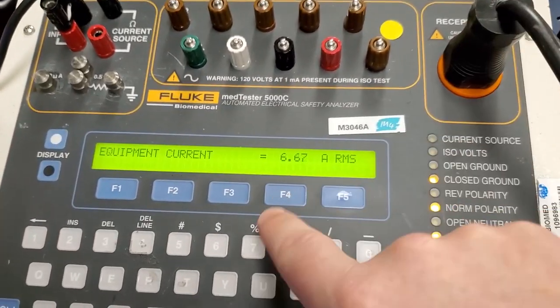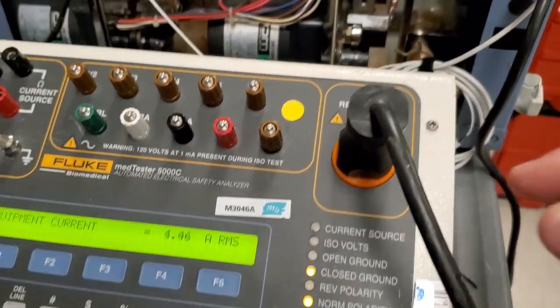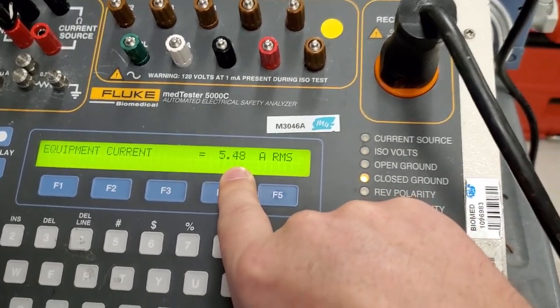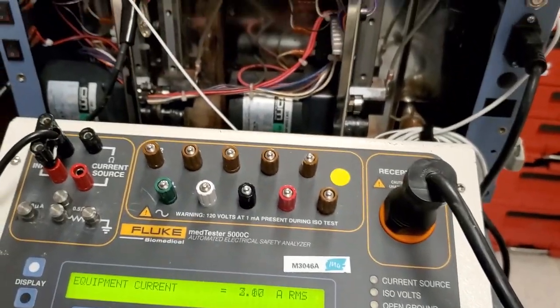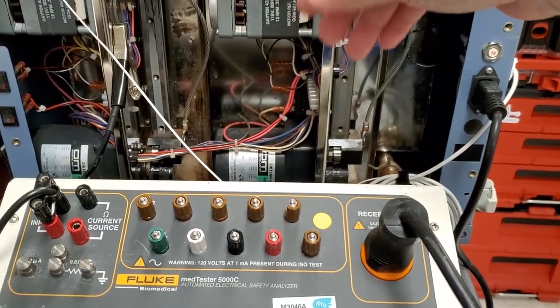Just connect your device, put it on equipment current, and then run the device. You can see it flip-flopping right here — this is caused by the heating circuit, because it is a heated water bath that's kicking the heating element on and off.